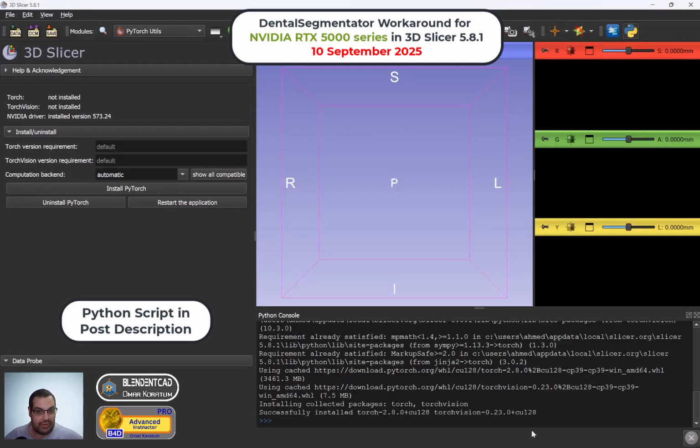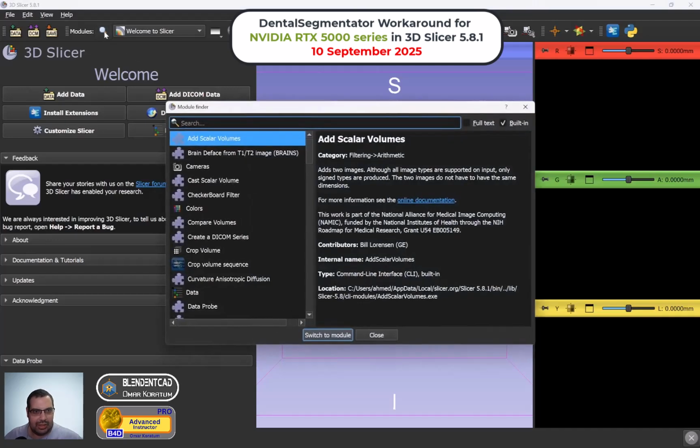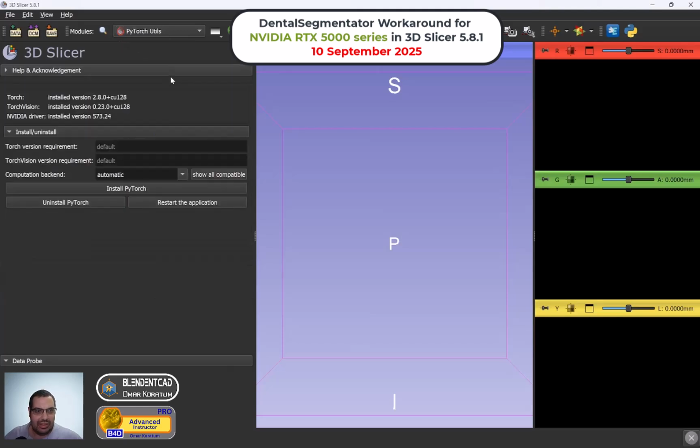Now it has finished installation of the new version. As you can see, here are the details of the new version, which is CU 128. You will see that it's not up to date, so that's why we have to restart 3D Slicer. Now I will go back to PyTorch utilities to make sure that it has been installed successfully, by pressing on this icon and then typing PyTorch and clicking on it. Now we will see that it has been updated to the newest version, which is CU 128.